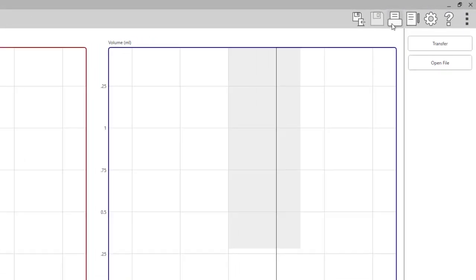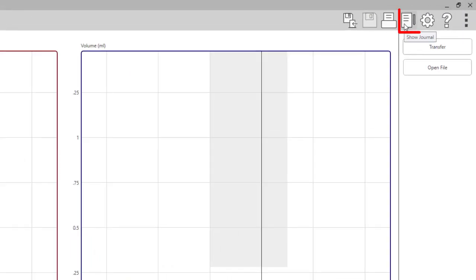This icon is the journal icon. You can use this to type notes related to the session. The notes will save when the session is completed and saved.